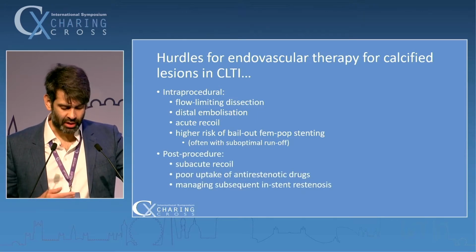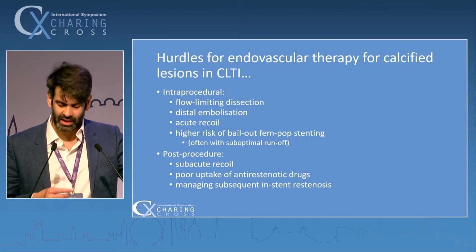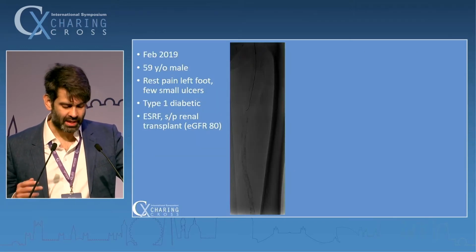Post-procedure, we're at risk of subacute recoil, poor uptake of anti-restenotic drugs, and managing in-stent restenosis when we do have to stent in a difficult situation. So let me show you some cases here.